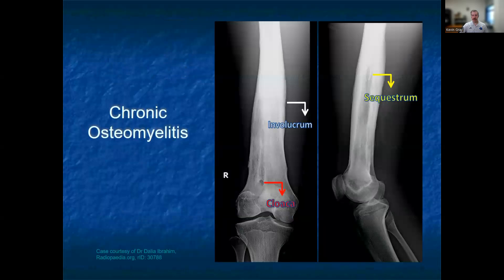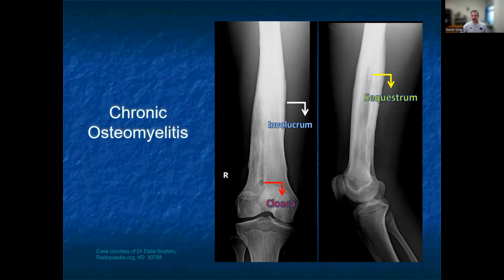An involucrum is a sheath of new periosteum overlying existing periosteum, giving a thickening appearance to the periosteum. Sequestrum is a bony calcification within a lucent lesion, and oftentimes this is seen within the marrow signal. A cloaca is an opening to the involucrum, which exits the bone and may connect directly to the skin via a sinus tract.